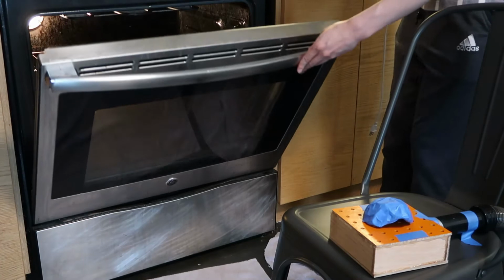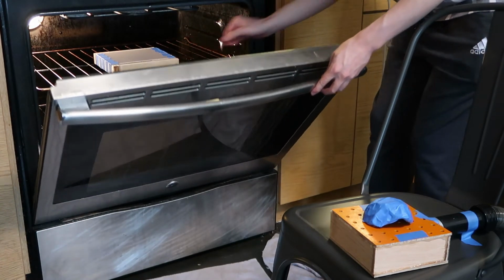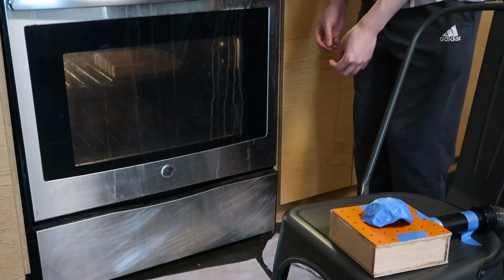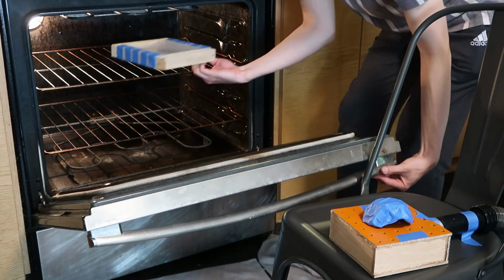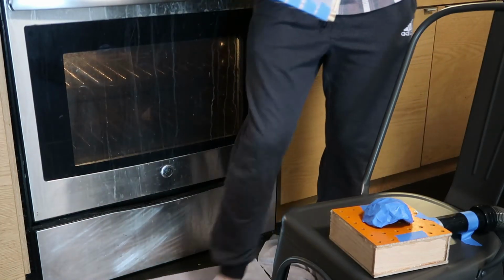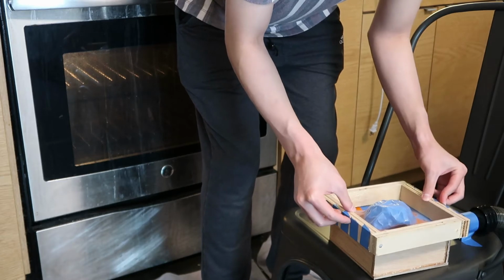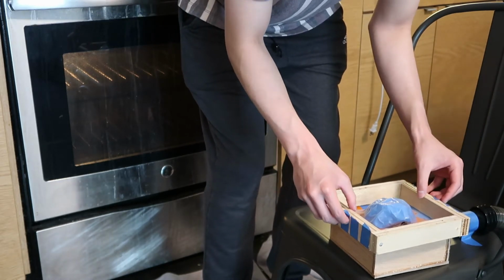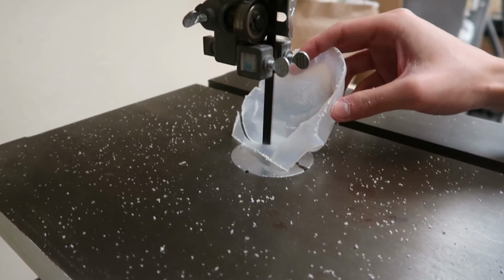Now that we have the mold, we have everything we need to actually make the mask bracket. I tape the polypropylene sheet onto the frame and I put it in the oven for 3 minutes or until it sags a little bit at 375 degrees Fahrenheit. Then I quickly carry over the plastic and push it against the mold and turn on the vacuum. Finally, I cut the excess plastic and sand it to cut it to shape.